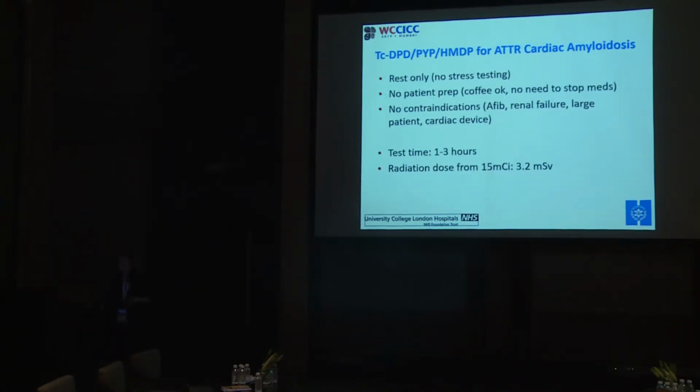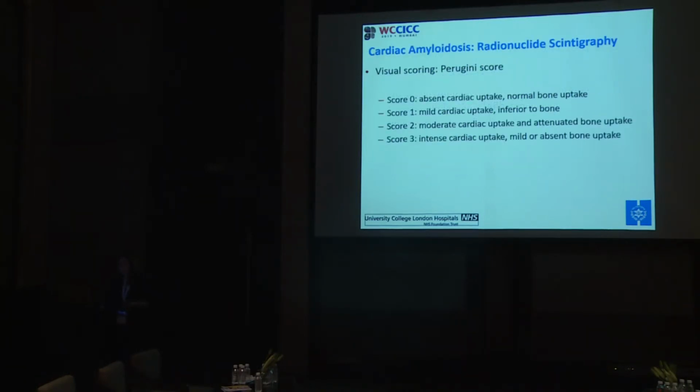How do we perform the studies? Very easy to perform, rest only, no patient preparation, no contraindications. The test time is 1 to 3 hours, and the 3-hour imaging is likely better, more specific, and the radiation dose is about 3.2 millisieverts.